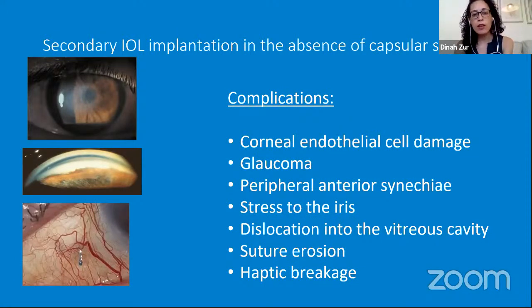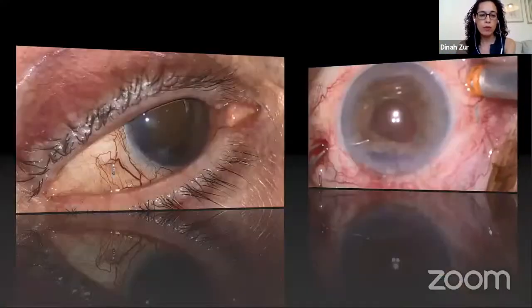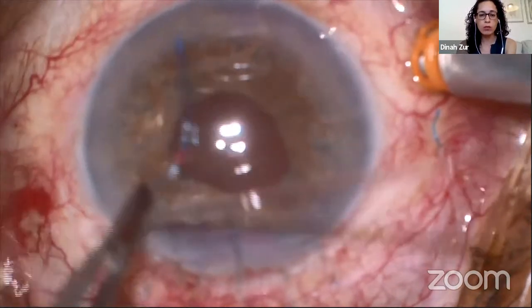complications or limitations, such as damage to the corneal endothelium. We see patients ending up with corneal transplants, glaucoma because patients develop anterior synechiae, stress to the iris because of the claw or because of the suturing, and of course also late dislocation into the vitreous cavity. The sutures can cause erosions and the haptics can break, as I will show you soon. So this is a worrisome example where you have erosion and the haptics out of the eye.